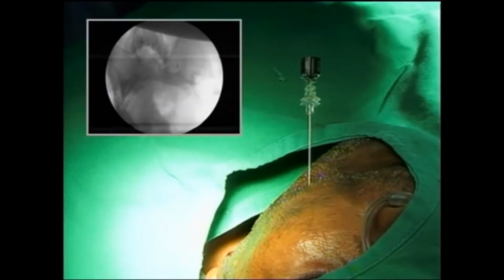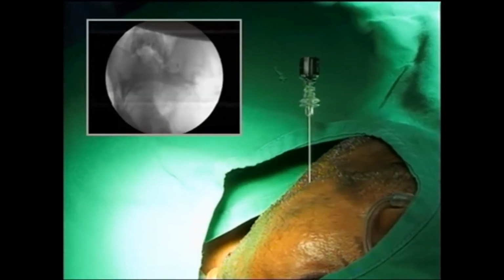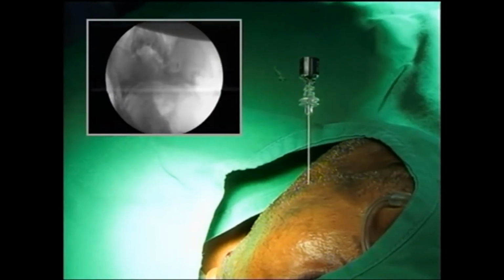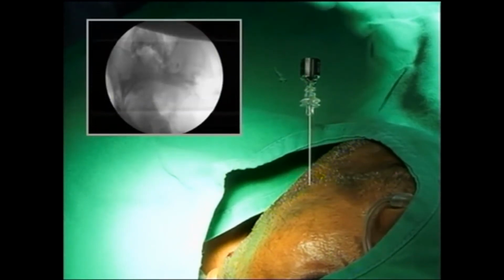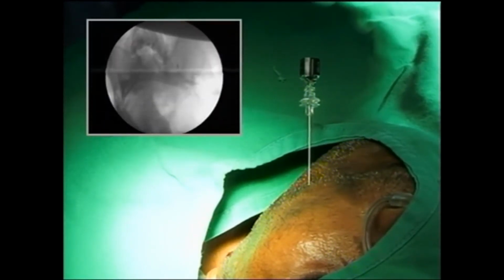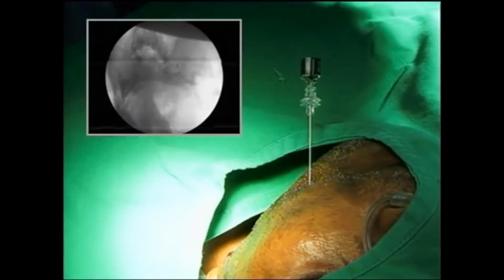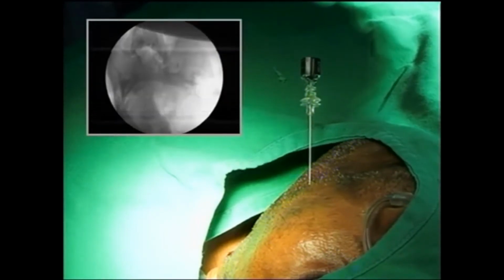Second is because through the foramen ovale, you get these structures here. You get the mandibular nerve coming out. You get the accessory emissary veins, and then you have other structures that are coming out. It's a vascular structure, and since you touch the mandibular nerve itself, the patient can have a little bit of discomfort here. If it's not possible to do it with a consciously sedated patient, it may not be a bad idea to give a short-acting anesthetic like propofol, and then once you're inside, awaken the patient for the stimulation itself.